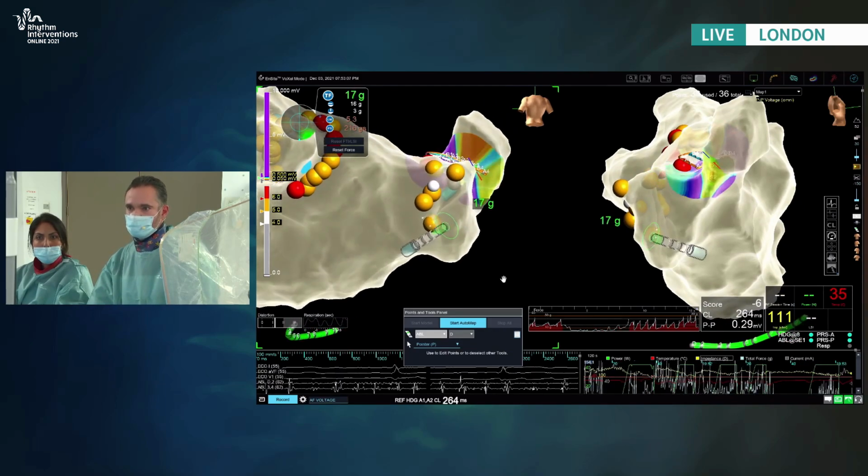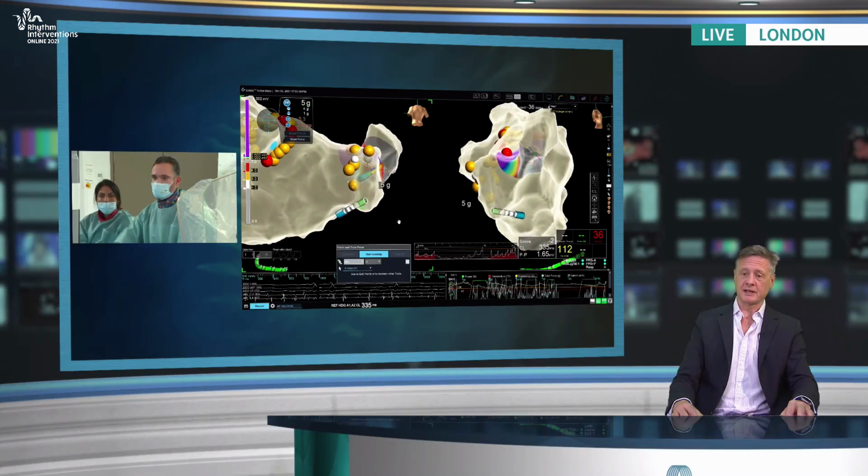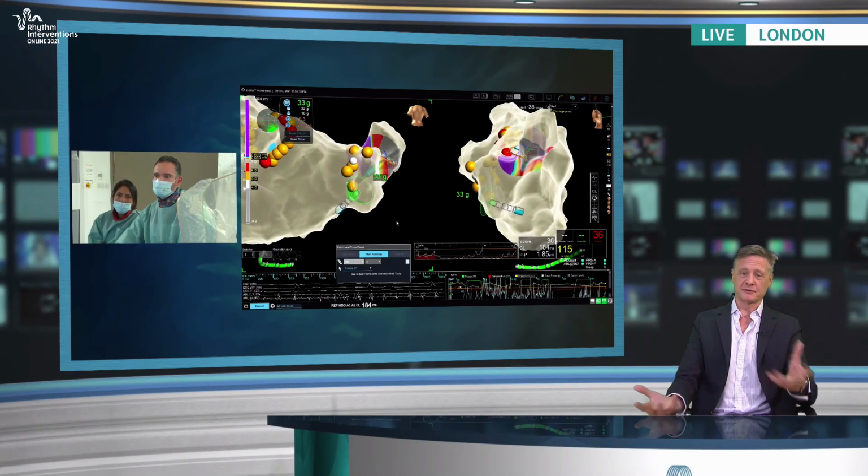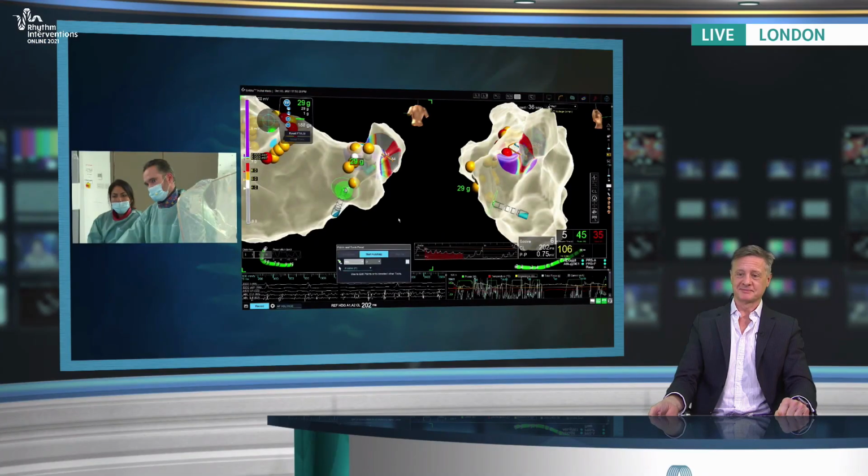But it's fascinating. It's a mark of our desperation that literally every faculty member has mentioned doing something other than pulmonary vein and posterior box isolation, when we still really don't know what to do. It's a big challenge.